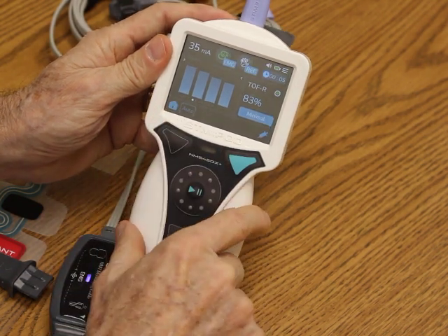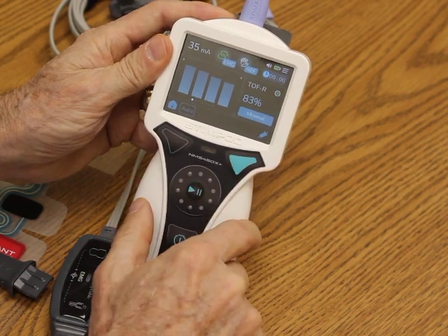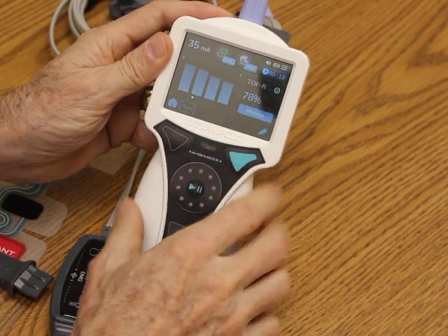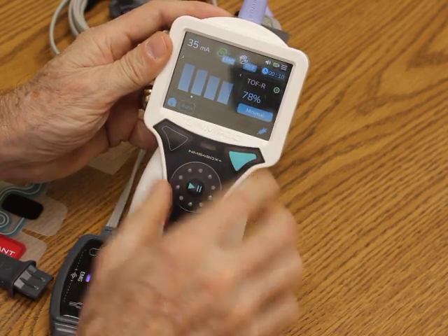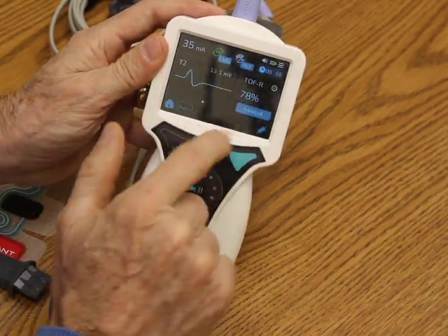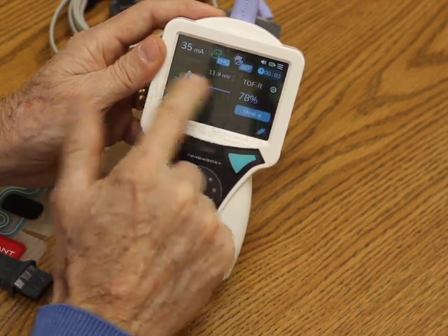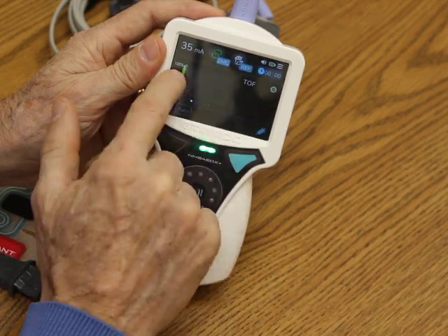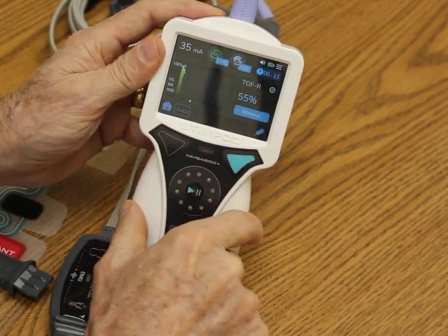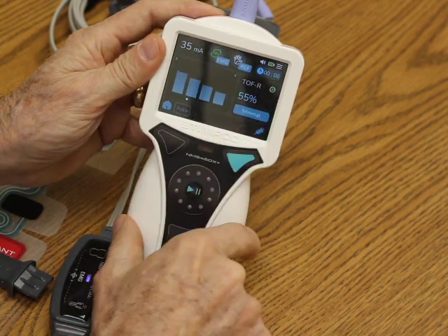Now I'm down to 83%. I can press this button to identify that I've given a paralytic or a reversal, and it'll show up later in the waveform. If I slide across, you're seeing the T4, T3, T2 — we actually show the waveforms, all four together. And then this is the beginning of the trend waveform, and that little zero on top is showing you where I did the drug event. Now we're down to 55%.